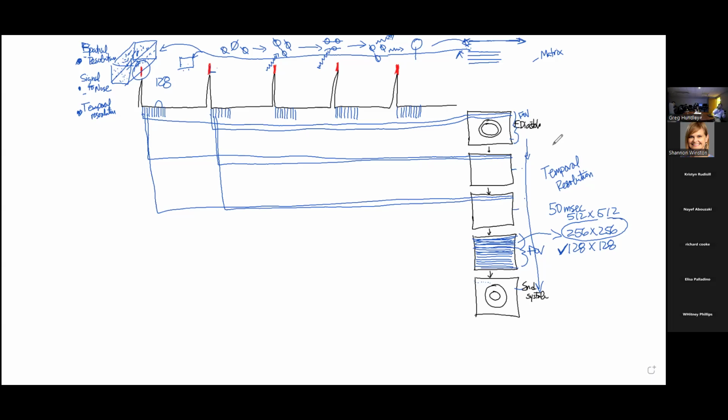The answer is when you've got that really high field strength and ability to change these gradients rapidly, you can fit a lot of these lines right in here, okay? And in fact, the TR, which is really the time it takes to acquire a piece of information in what we call K-space, can be dropped as low as 7 milliseconds. Good gosh. And what that allows you to do is group.